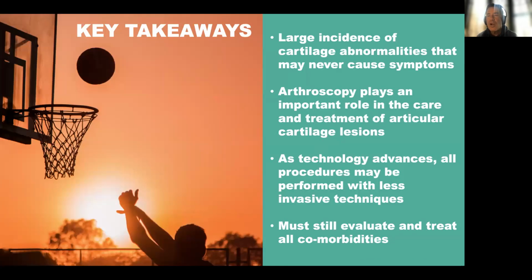So in summary, there's a large incidence of articular cartilage disease that may never cause symptoms. Arthroscopy does play an important role in the care and treatment of articular cartilage lesions, and as technology advances, all procedures may be performed with less invasive techniques. But keep in mind that we must still evaluate and treat all comorbidities.